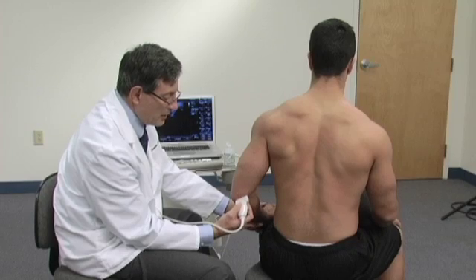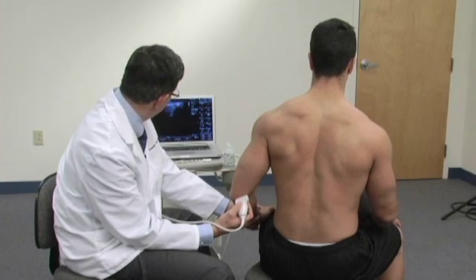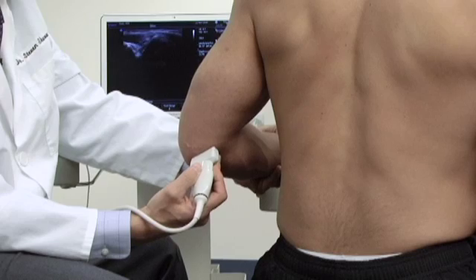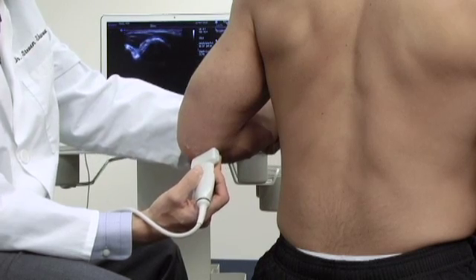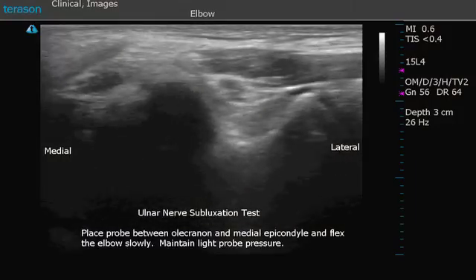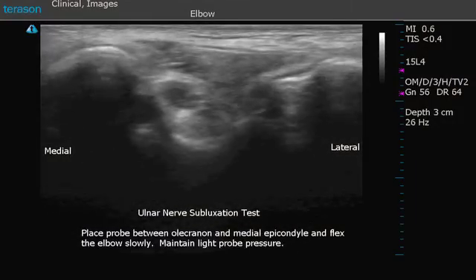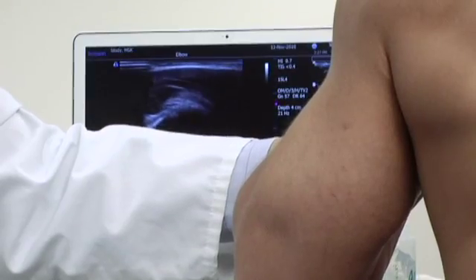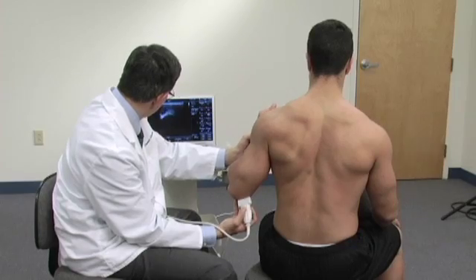A dynamic study can be done where we take the arm from being extended to being flexed and watch the ulnar nerve to see if it subluxates over the top of the medial epicondyle. We want to be careful not to use too much pressure with the probe, because that can prevent the nerve from moving. In this case the nerve remains in the proper position.